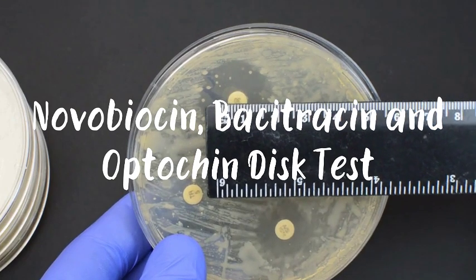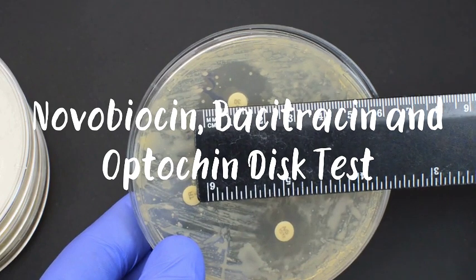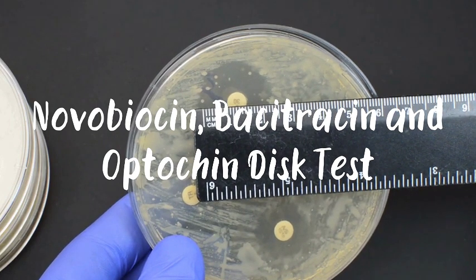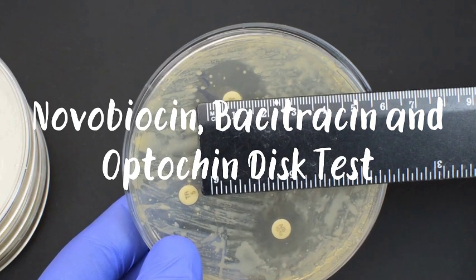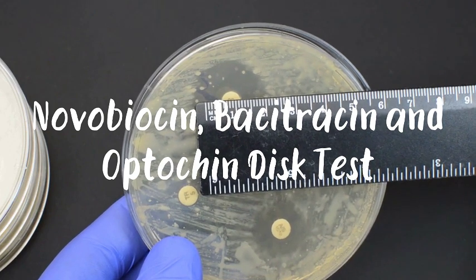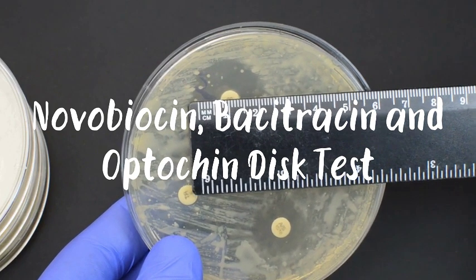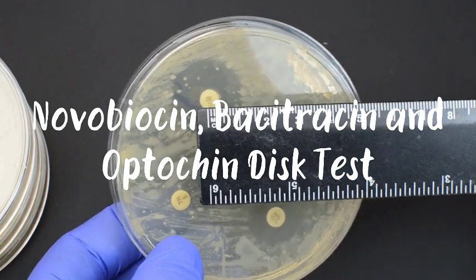Novobiocin, bacitracin, and optochin discs are used for antimicrobial susceptibility testing, wherein these three are antibiotics used to determine what species of Staphylococcus or Streptococcus is being detected.